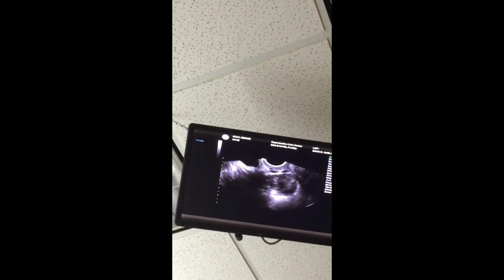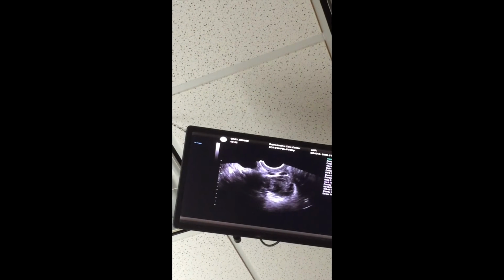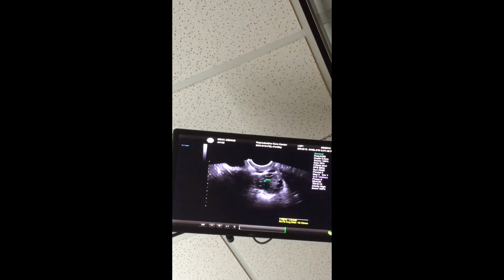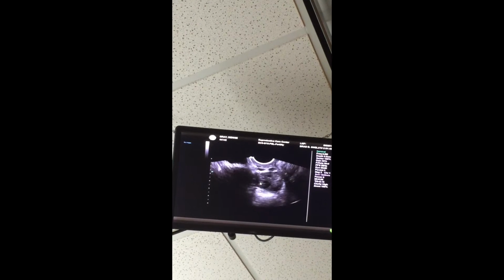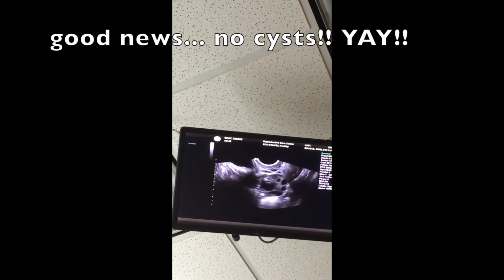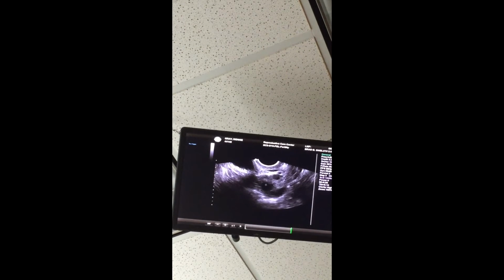The answer is yes, but I say not yet because I have to finish looking at the rest of the ovary if I do see one. So far, I'd say they're just small follicles, which is what you want. Awesome. And that looks good. What do I want when I measure them like this?